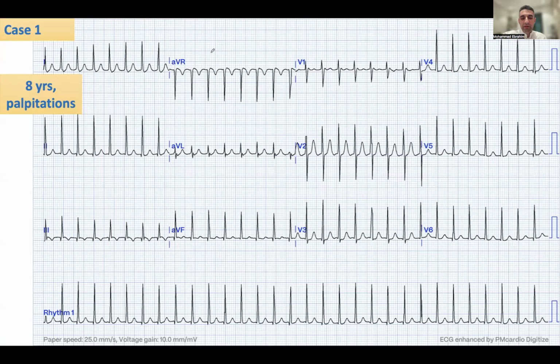So as you can see, there are people typing. Okay, so I do see tachycardia junctionale, I guess, and AVNRT. Okay, so definitely the patient is tachycardic. Her heart rate is around maybe 180 beats per minute. The patient is resting in clinic or in the emergency room, so there is no explanation for him to be this fast.